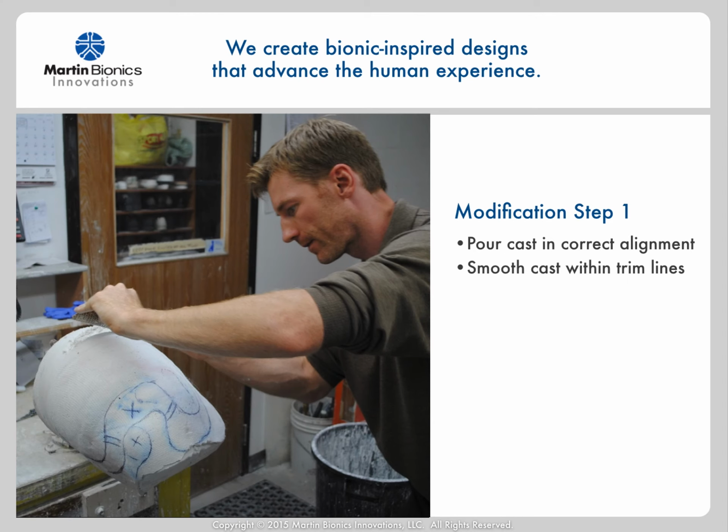The only areas of the cast that we need to modify are that which is within our trim lines. Begin by simply smoothing the cast within these trim line areas. Take off any high spots that may have occurred from roping in the plaster. There's a lot of forgiveness with this socket modification. All we really need to end up with is the surface contouring.